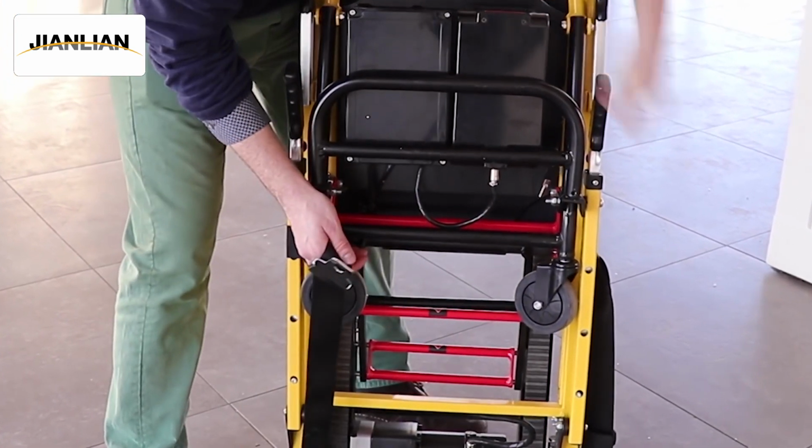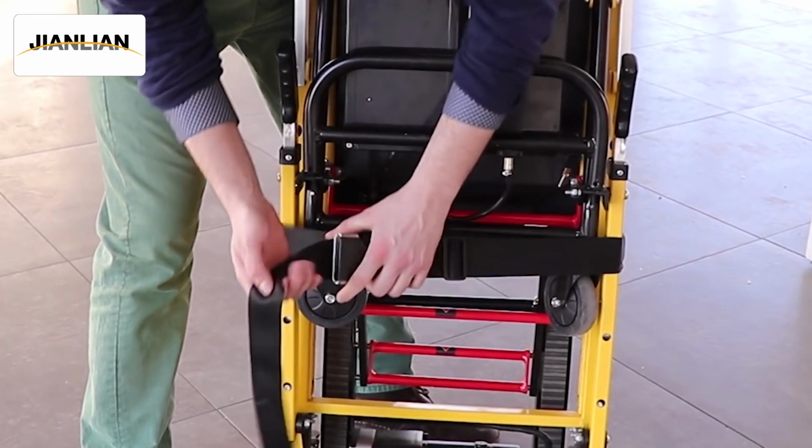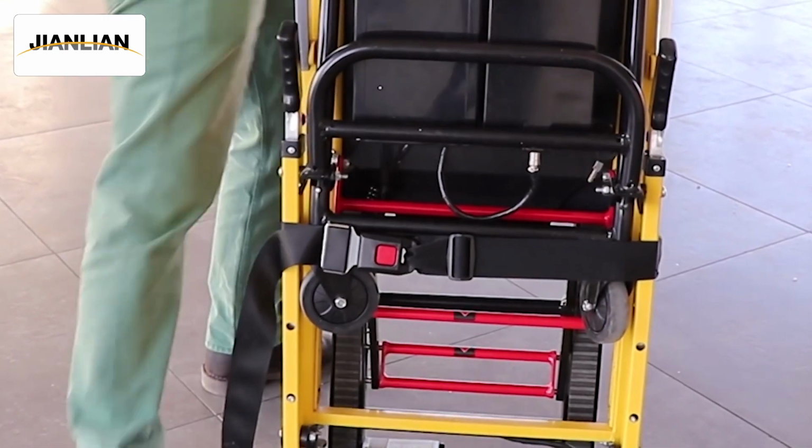Finally, fasten the seat belt around everything to hold everything in place. The chair is now ready to be stored or transported.